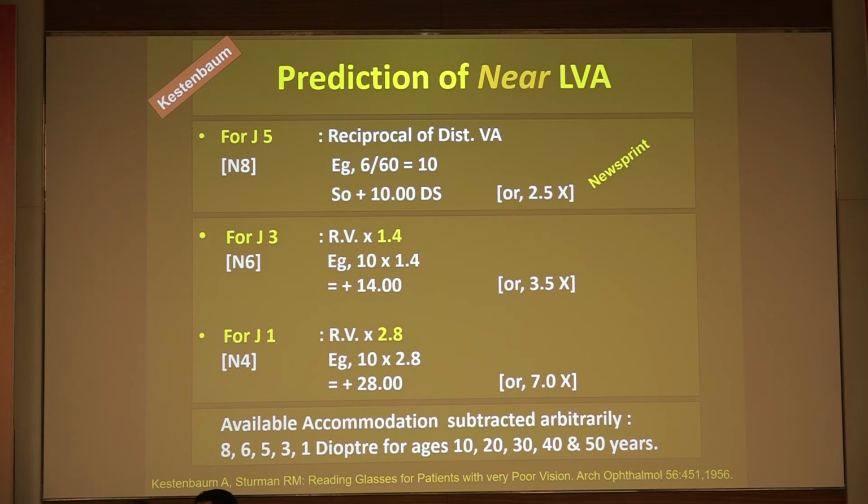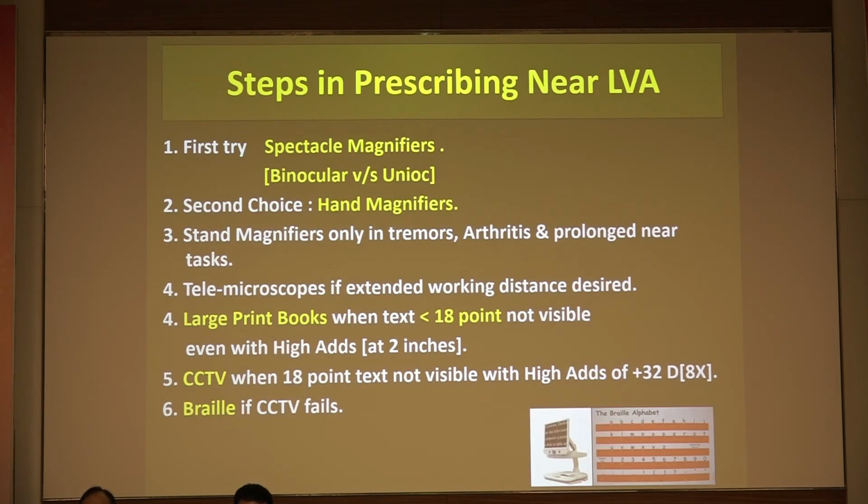You have to play with the magnification. Whatever magnification you have predicted, you can go 1 or 2 steps above or even below, depending upon the comfort level and the desire of the patient. So these are the steps when you're prescribing near LVA.